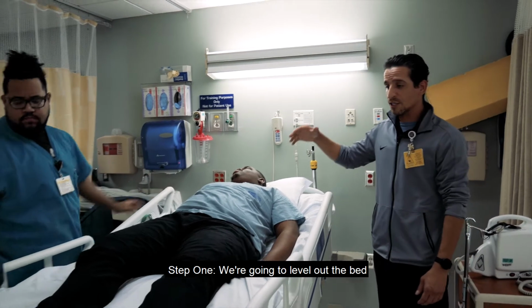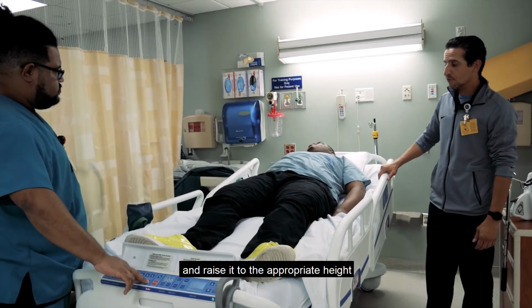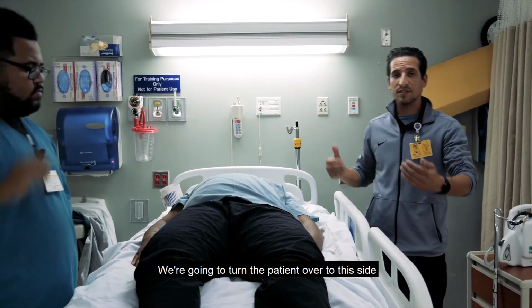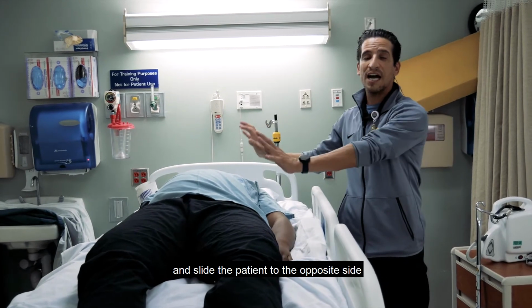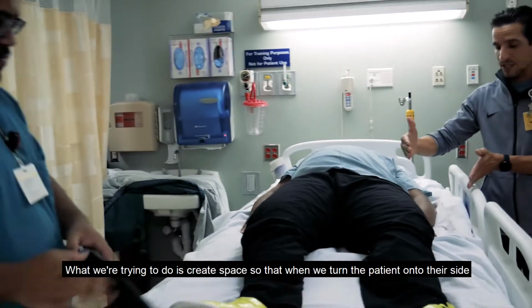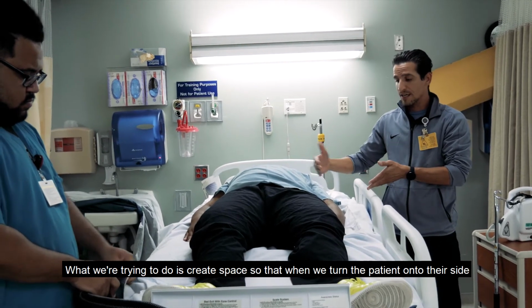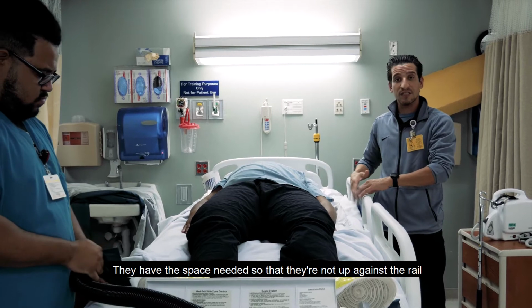Step one, we're going to level out the bed and raise it to the appropriate height. We're going to turn the patient over to this side, so we're going to use the hover mat and slide the patient to the opposite side. What we're trying to do is create space so that when we turn the patient onto their side, we have the space needed so that they're not up against the rail.